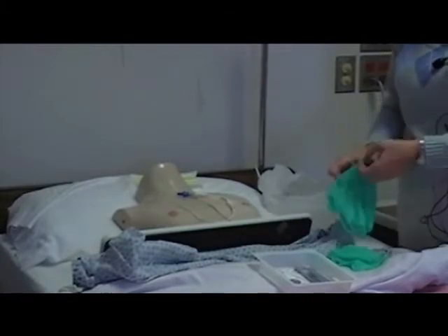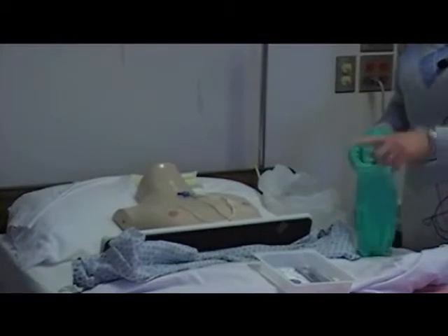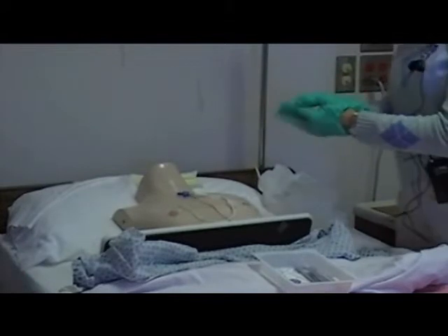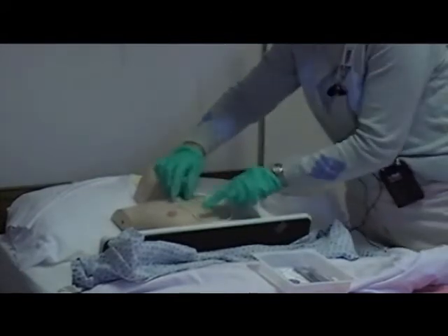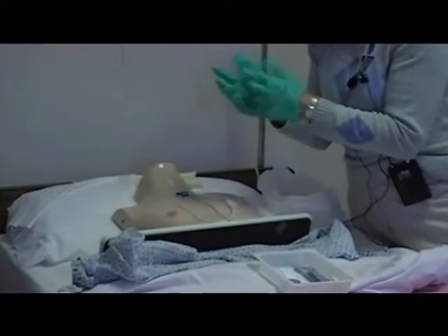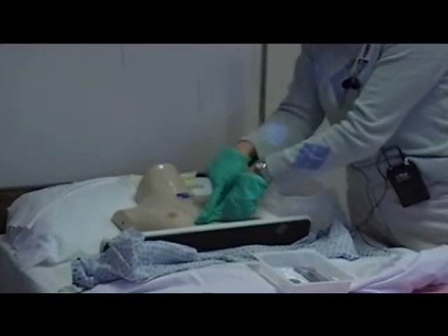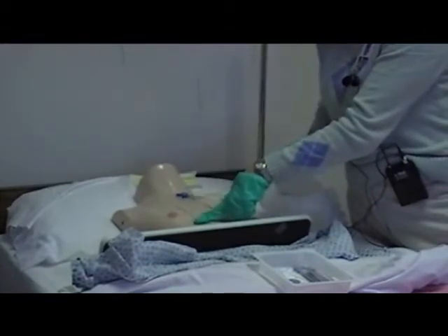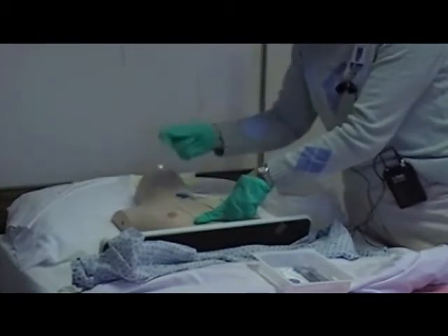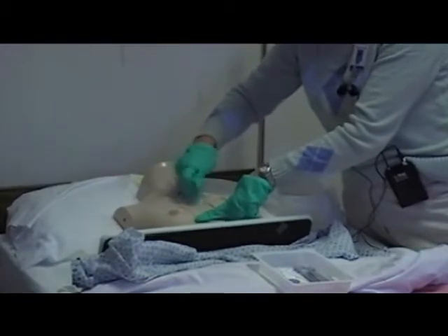I will apply my clean gloves, and I am not turning my back on my sterile supplies that I've got set there right now. I'm going to secure with one finger. Make sure you get clean gloves that actually fit you. These are too big. The dressing ends right here. I am holding down the catheter with one finger so that I do not dislodge that catheter as I pull off the dressing. Now I do not want to touch the skin underneath that dressing.